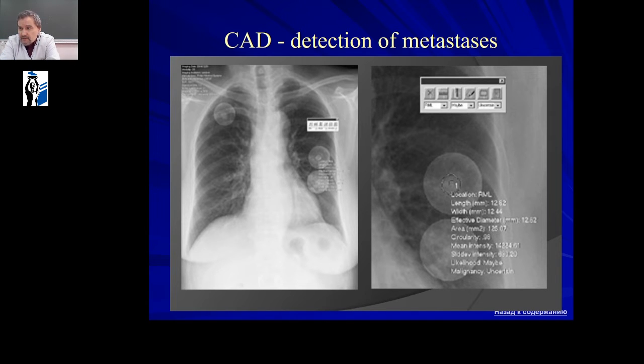There is a way that dramatically reduces the likelihood of an error. This is a second opinion or a second view. In this case, a computer system can act as a second opinion. The system has competences for recognizing formations that a person can easily miss.